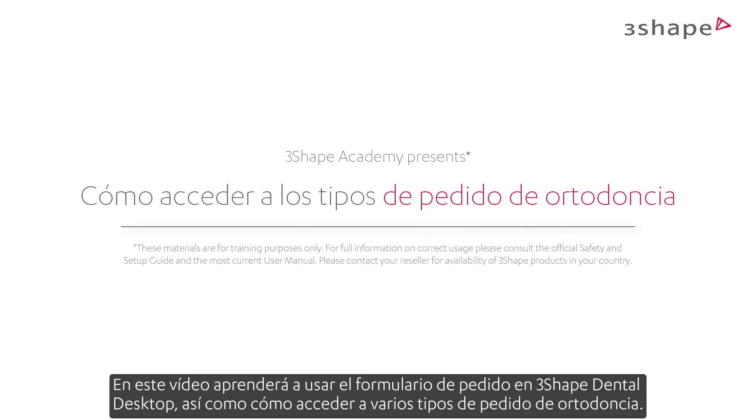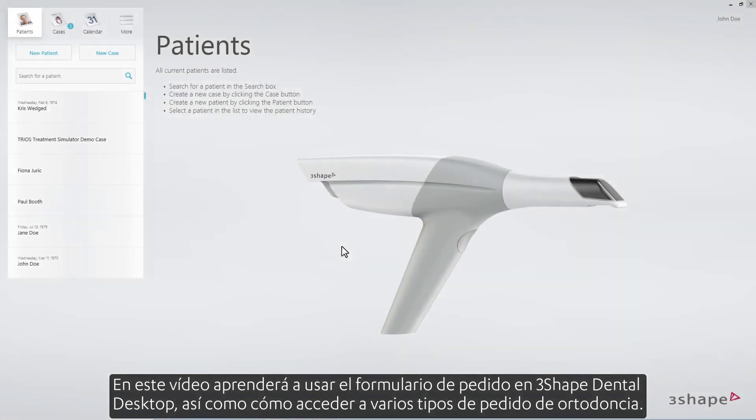In this video, you will learn how to use the order form in 3Shape Dental Desktop, as well as how to access various orthodontic order types.